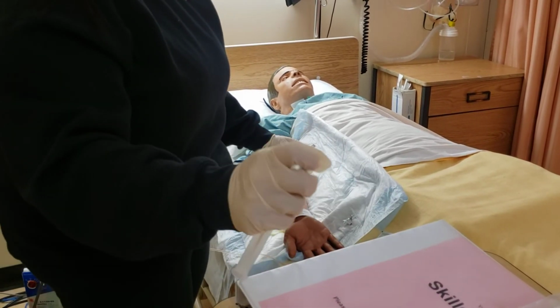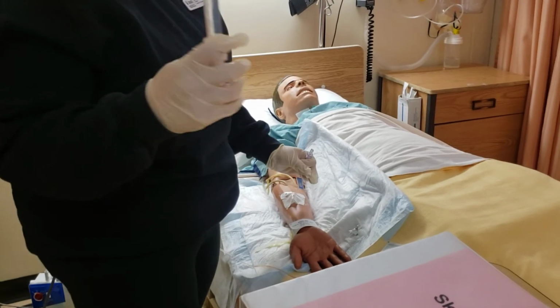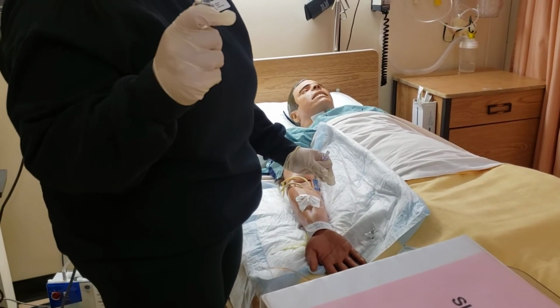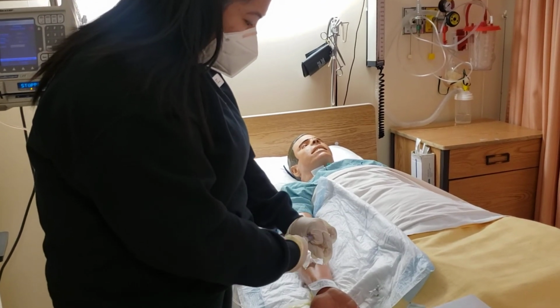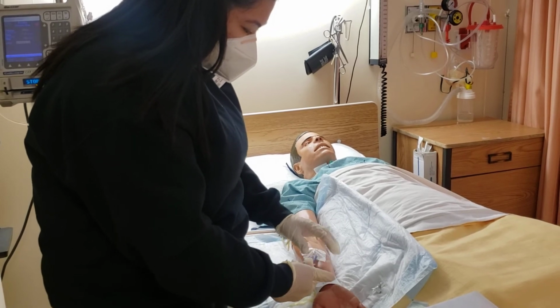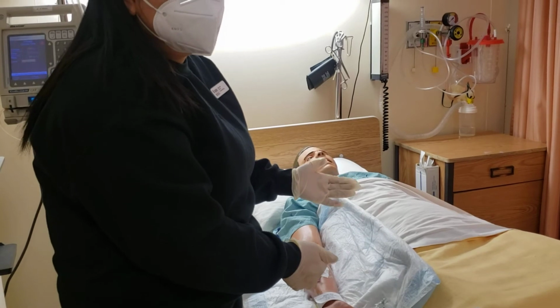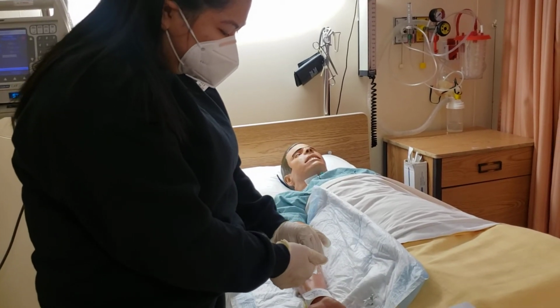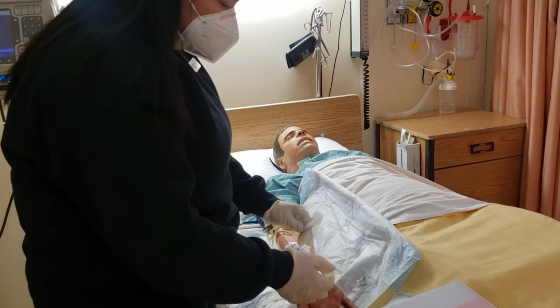I will use a flush and get rid of the air bubbles. Then we're going to connect that to the IV site, making sure it's not clamped. Then we'll flush and check if there's any resistance. There's none, so that indicates our IV site is patent.